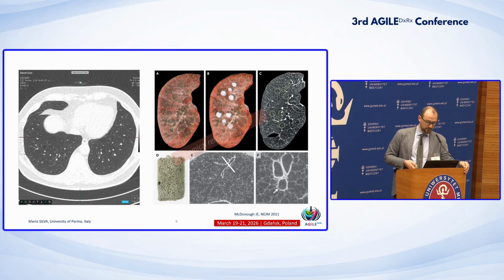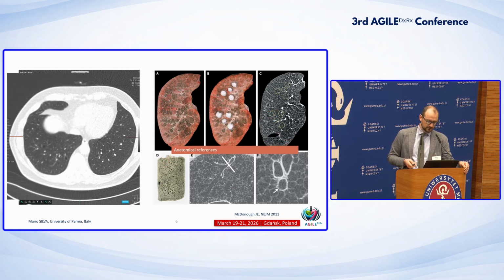So we can start from here, because here we have the anatomical references, and we can extrapolate what we think this other thing should be to get to that point. So we have an anatomical reference, and then we have something that we have to optimize. You've seen this slice being cut in two pieces.